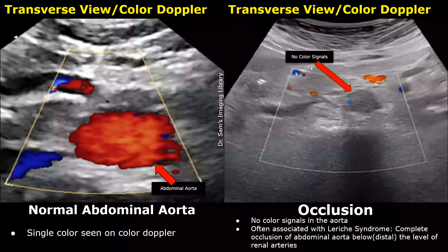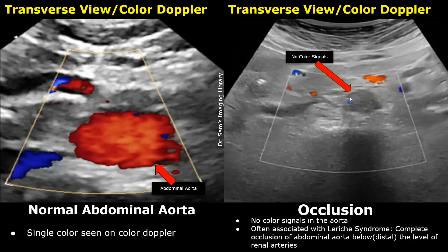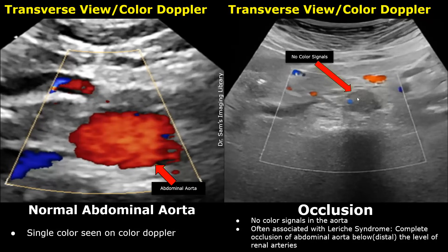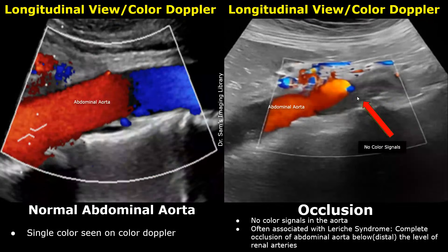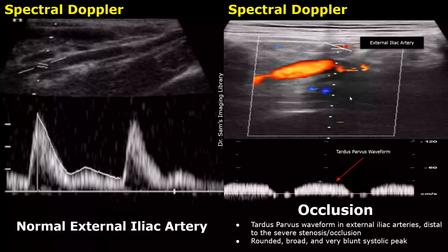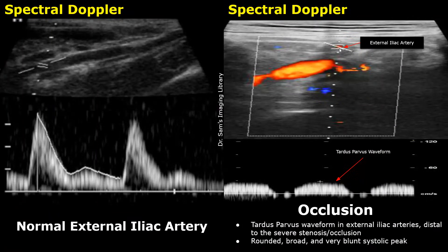In occlusion, there is a complete blockage in the aorta and the lumen is completely obstructed. This is rare and usually occurs in a condition called Leriche syndrome — a chronic occlusion of the terminal abdominal aorta and/or iliac arteries, typically due to advanced atherosclerosis, leading to reduced blood flow to the lower limbs and pelvic organs. No color signals are present in the aorta on color Doppler because it is occluded. In a longitudinal image, you can see the plaque completely blocking the artery.